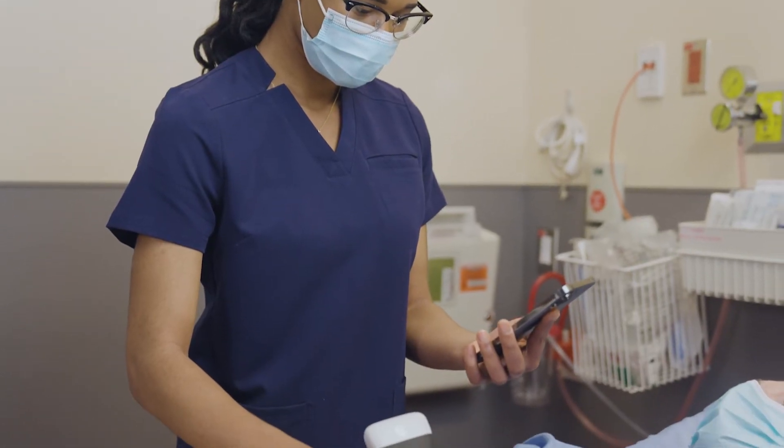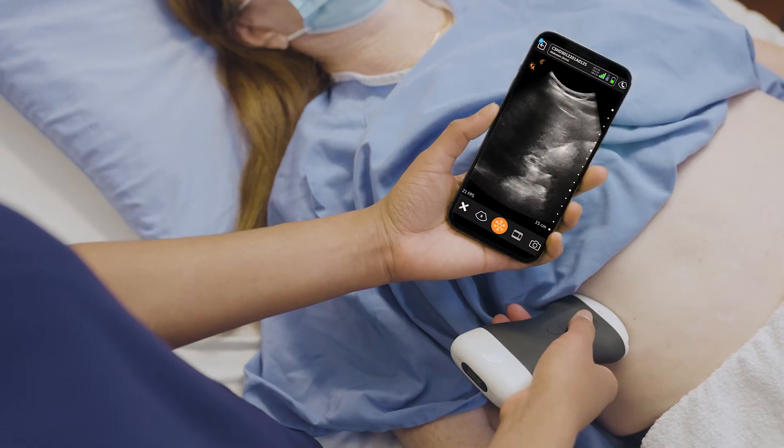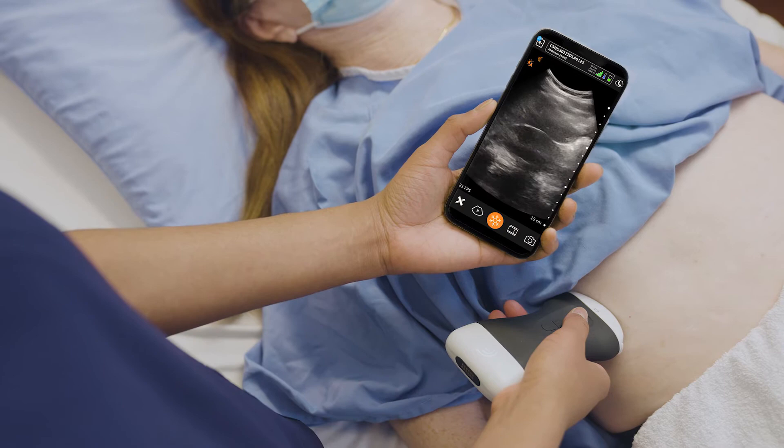I got involved with ultrasound as soon as I arrived in South Carolina 26 years ago, and I've just been fascinated with every realm of the technology.